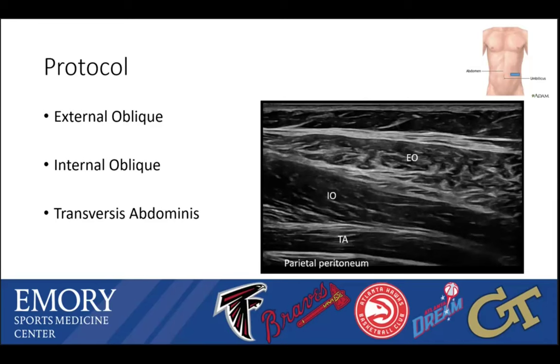Remember that the external oblique runs inferomedially, while the internal oblique runs superomedially. And these should each be inspected over their entire course, especially where there's concern for pain with sonopalpation. And while it can be challenging, I think it's helpful to visualize the longitudinal and transverse views of each of these muscles in their distinct orientations to get a sense for the anatomy, especially if the complaint is somewhat vague or maybe subacute.